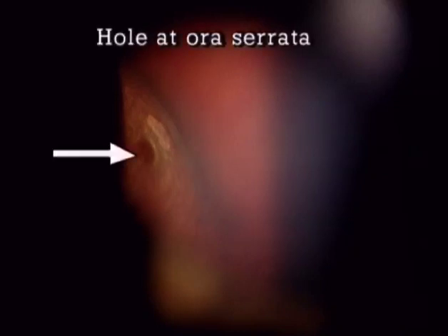This is shown here by a retinal hole just behind the ora serrata. When shifted from the anterior face of the protuberance towards the summit, the hole appears at high contrast because a previously invisible retina edema has now become white.